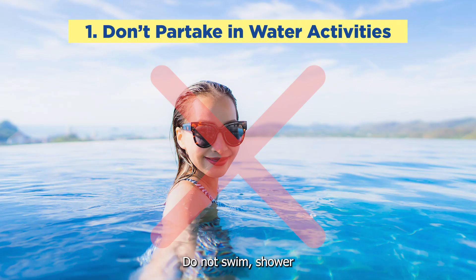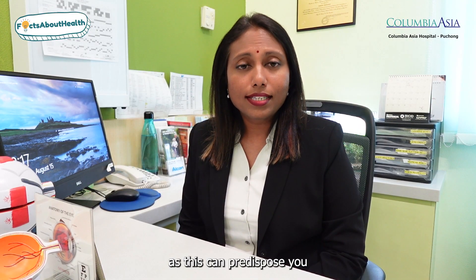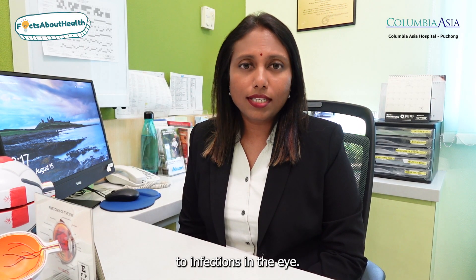Number one: do not swim, shower, or do any activity that will get water into your eyes while you're wearing contact lenses, as this can predispose you to infections in the eye.